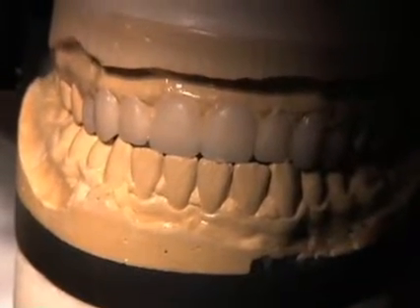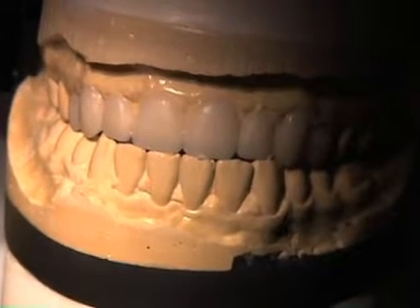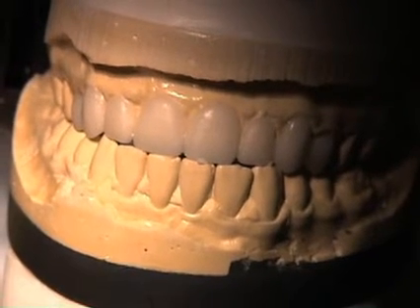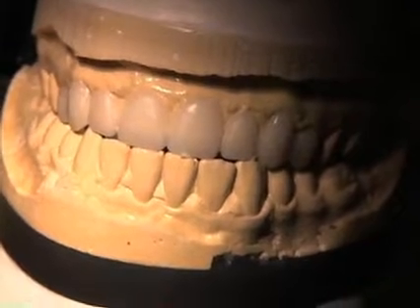Then we're going to transfer a diagnostic wax-up to the prepped teeth using a template. From that template we will capture images using the CEREC unit, and those images will be used to create new veneers that have the same contours as the diagnostic wax-up. As you can see from this diagnostic wax-up, we've recreated a smile line that is in symmetry and also has good occlusion. This is what we're going to copy using the CEREC technology.